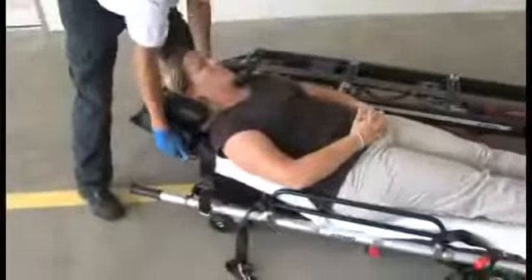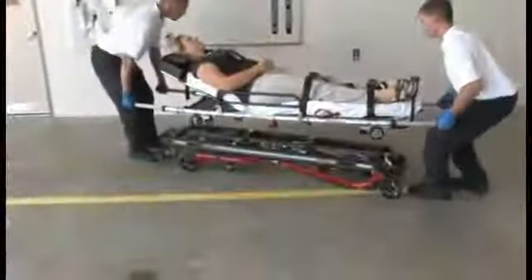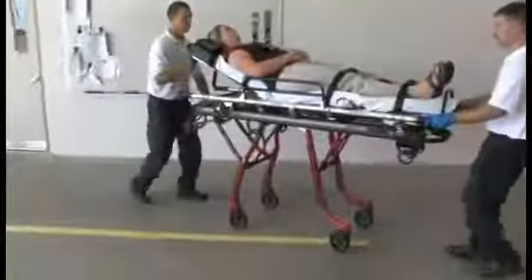Now raise the side arms, adjust the backrest and shock frame as needed, and fasten and adjust the patient restraints. Be sure that sheets and other articles are positioned where they will not interfere with the operation of the transporter. You may now place the stretcher onto the transporter if needed. Raise the transporter to a rolling position and roll the cot.